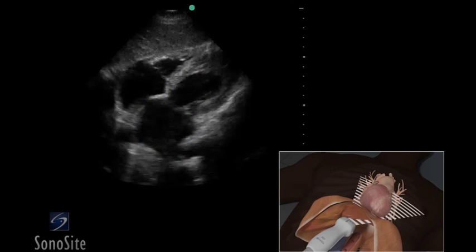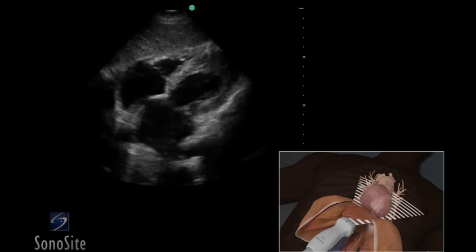The myocardium will appear gray, and the blood-filled chambers will appear hypoechoic. The bright white pericardium is seen surrounding the heart adjacent to the gray myocardium.